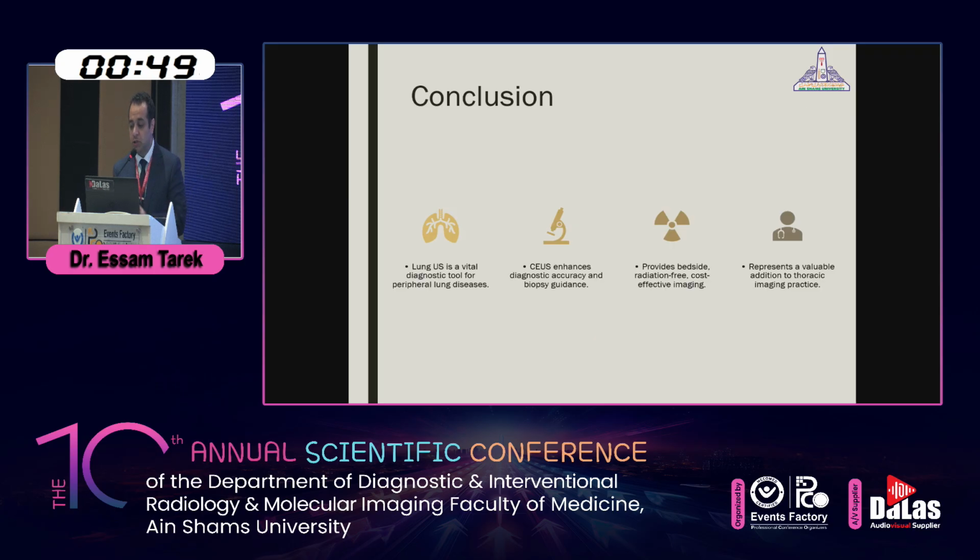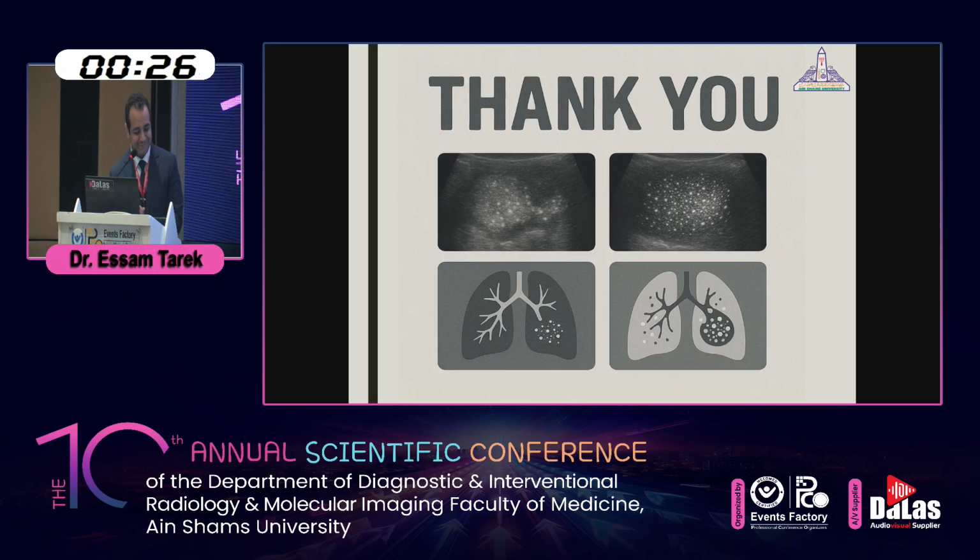For the conclusion, lung ultrasound is now an essential bedside diagnostic tool, particularly for peripheral lung disease. Contrast-enhanced ultrasound extends the role by improving diagnostic accuracy and guiding biopsy safely. Its cost-effectiveness and portability make it a valuable complement to CT and X-ray. Thank you so much.